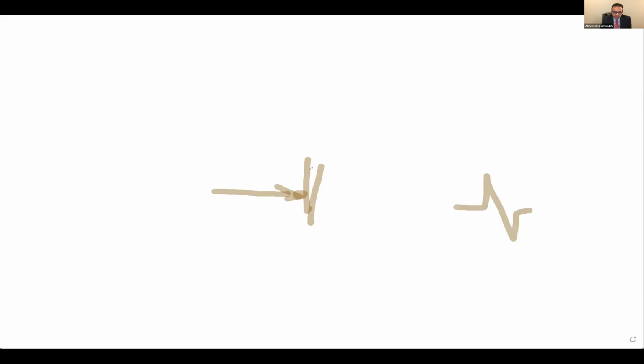But in this outflow tract, what we talked about, you have your RVOT, you have your LVOT, and these areas are very close to each other. So if you pace from here, or somewhere here, you can capture this area, this area, this area. So it is not always perfect that you are going to get the most perfect pace map sometimes, and that certainly has some limitations while doing pace mapping.